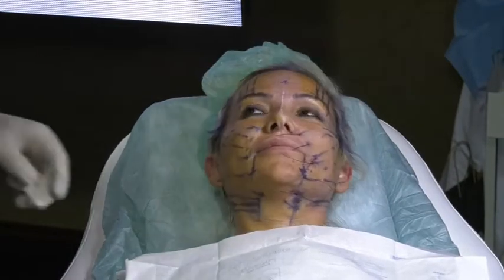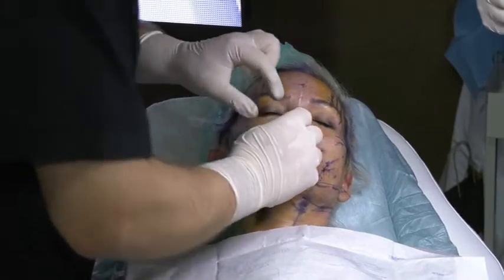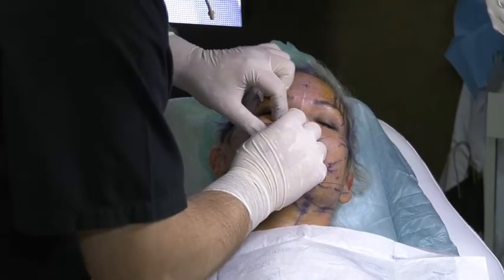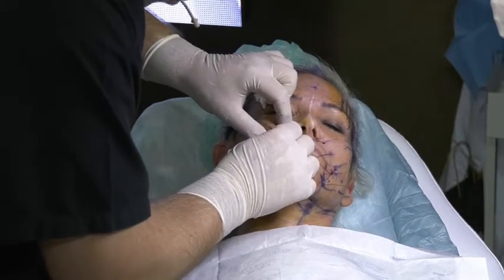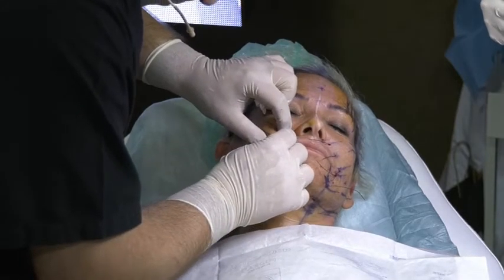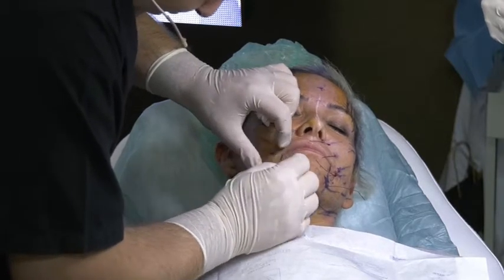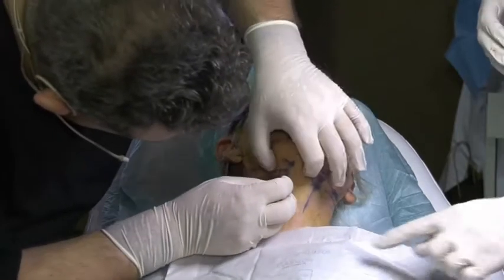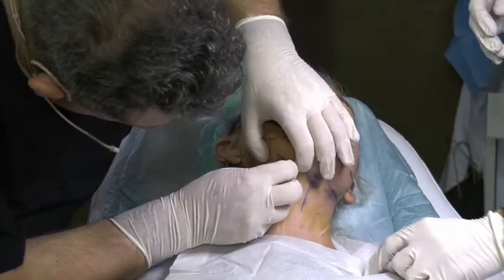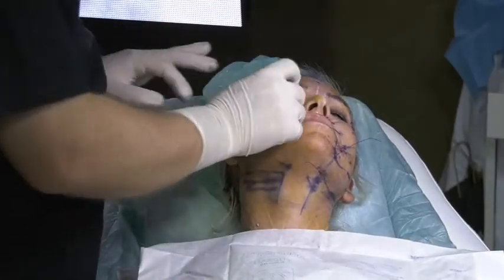So now again, I hold the tip. I work with the tip. Relax, madam. Okay? Like that. 1. Like that. 2. Like that. 3. Okay? Like that. Number 4. Number 5. And number 6. Okay? Thank you. We will start application.